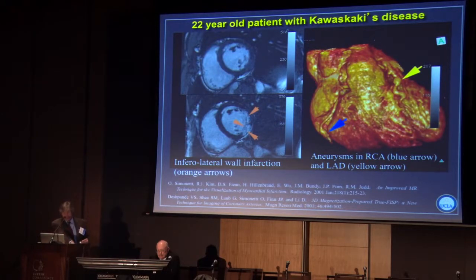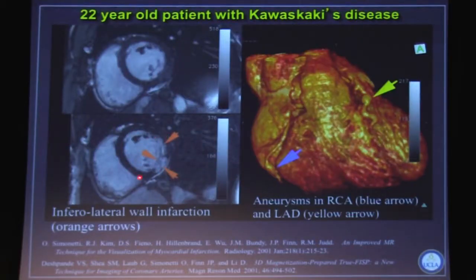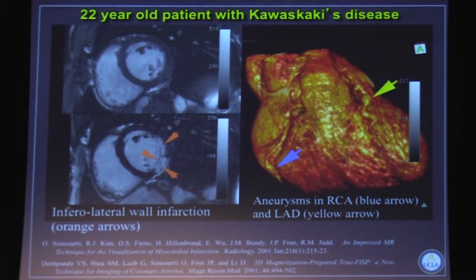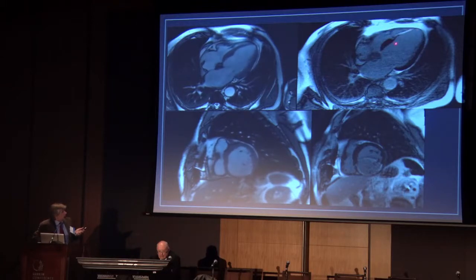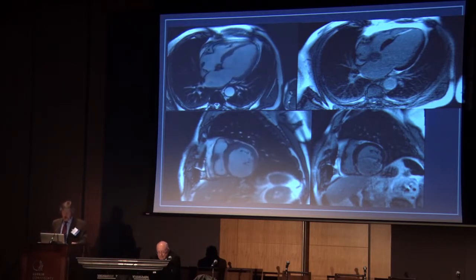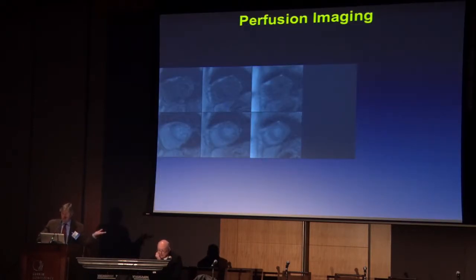That can be seen here in this contrast-enhanced delayed image showing enhancement of a good portion of the myocardium in the infralateral wall, due to a transmural infarction. This is most commonly used to look at patients with ischemic heart disease. Here's a patient with a big septal infarct, and also an infarct in the inferior and infraseptal and infralateral wall. This is where most of the action is numerically, but it can also of course be used in congenital heart disease, though it tends to be used less commonly.